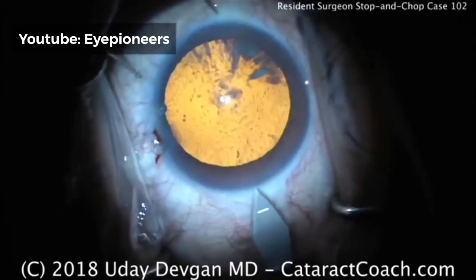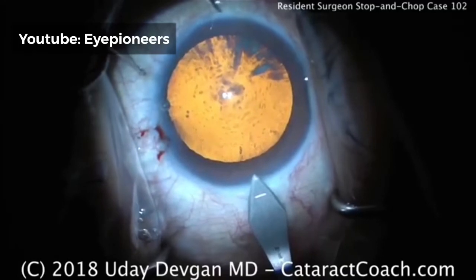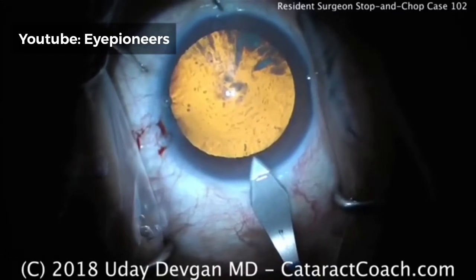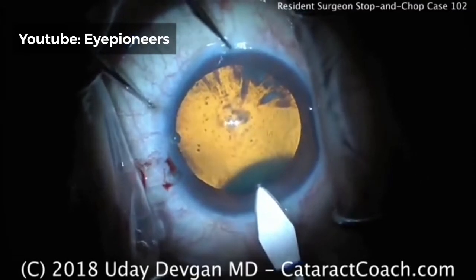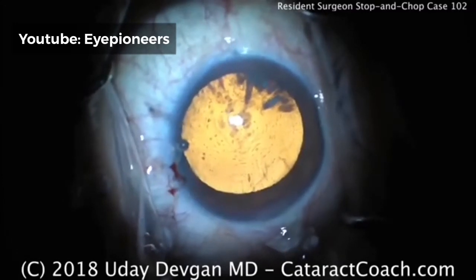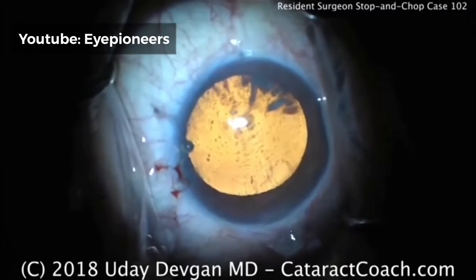Here's the main incision — fixating the eye with forceps. Here's the keratome and a temporal incision, hitting epithelium there, advancing it in the stroma. Tunnel length looks just great. Entering the anterior chamber right about now — there's Descemet's layer. You can see how much viscoelastic came out of the eye; that's very typical for a cohesive. That was a very nice incision that'll seal well and provide an appropriate amount of maneuverability inside the eye.